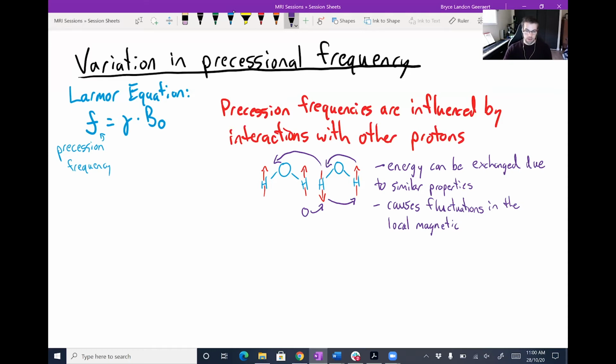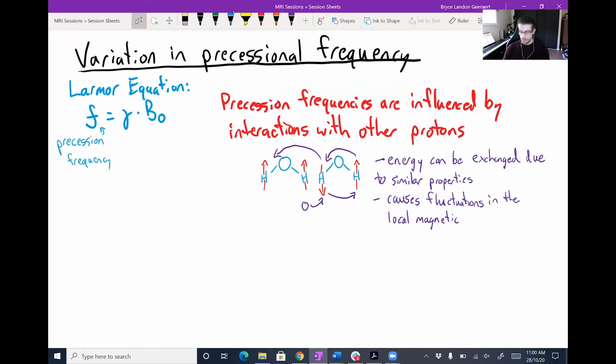Okay, so the question here is, I thought the B1 pulse caused the NMV to flip into the transverse orientation. It also syncs them up. Yes, essentially. This misalignment of ideas is because we're switching from talking about classical physics and vector interactions, where if you have a vector that's exerting a force on another vector, it can cause some tipping. And that view makes the most sense for MRI.